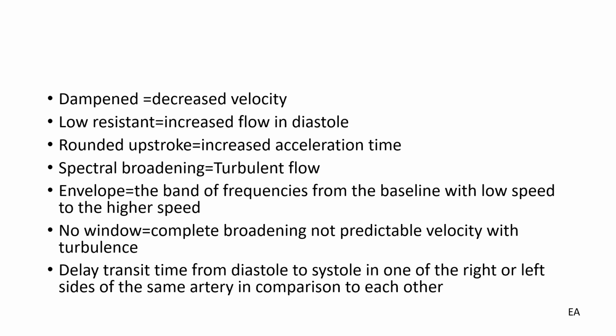So we have here the y-axis and time. Proximal stenosis: we are with the transducer distal to the stenosis. We are distal, but the stenosis is proximal to us, so it is near the heart.